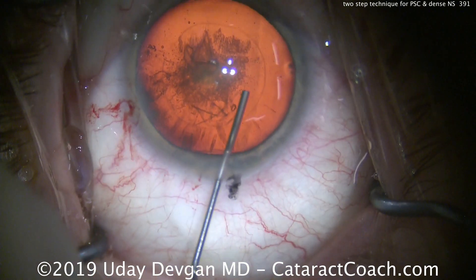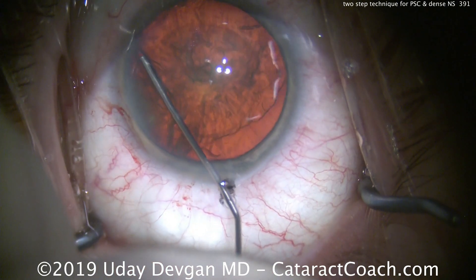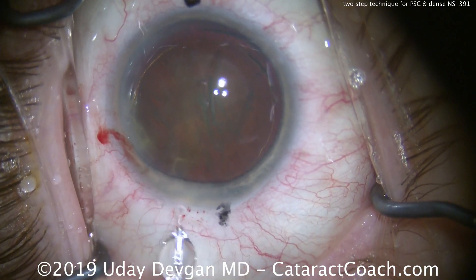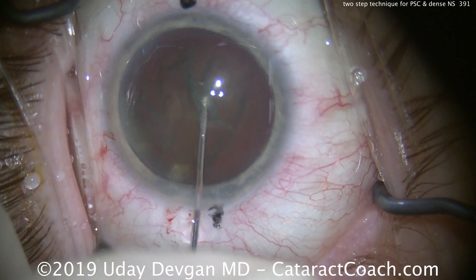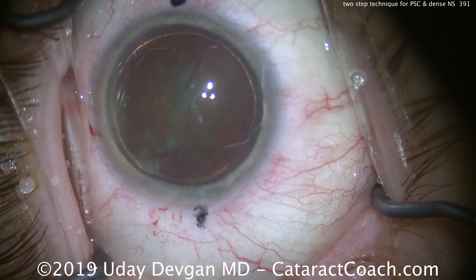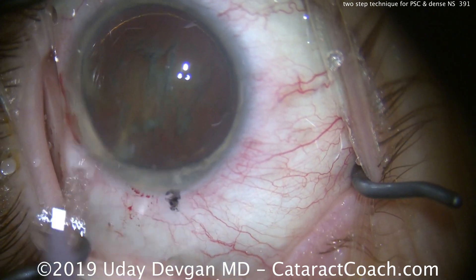Here's the technique. We're going to first do a hydrodissection, which separates the capsule from the posterior plaque. Then hydrodelineation — there's the golden ring of delineation — which separates the endonucleus. The two-step is: first, use the phaco probe and chopper to chop up the endonucleus, getting out the dense central part. Then use the probe to aspirate away the epinuclear shell, which will contain the posterior plaque opacity.